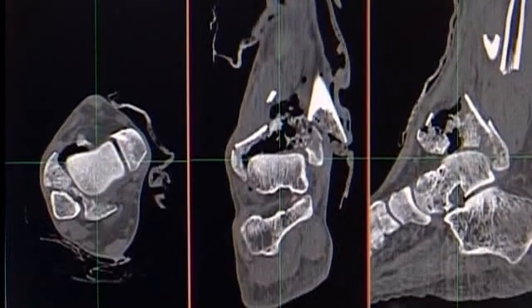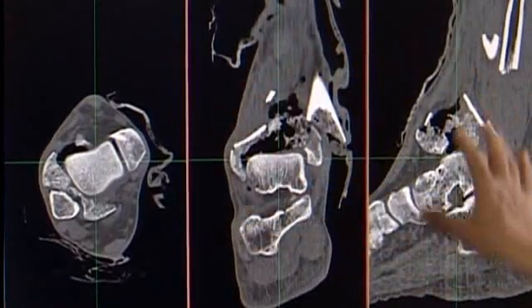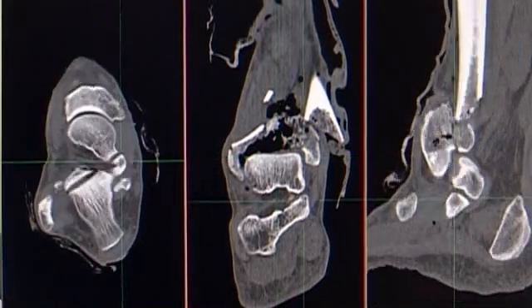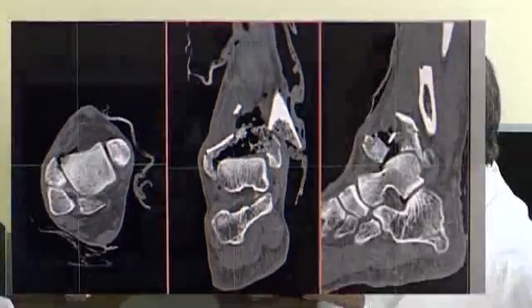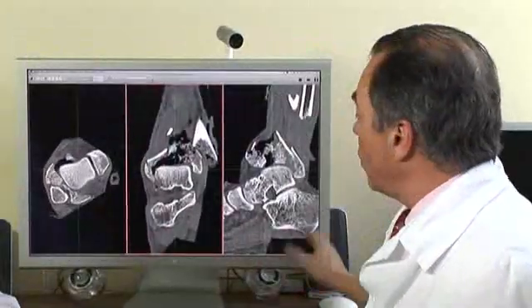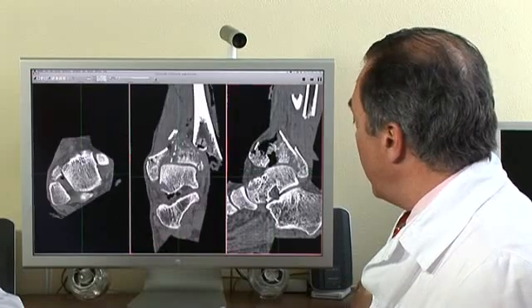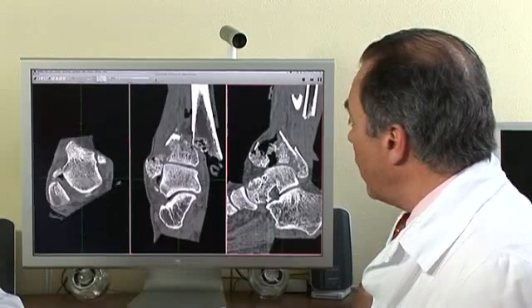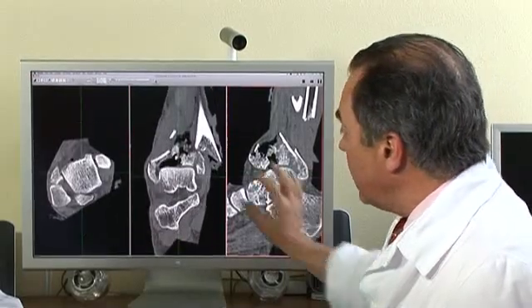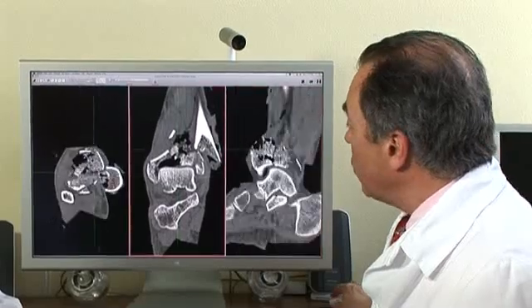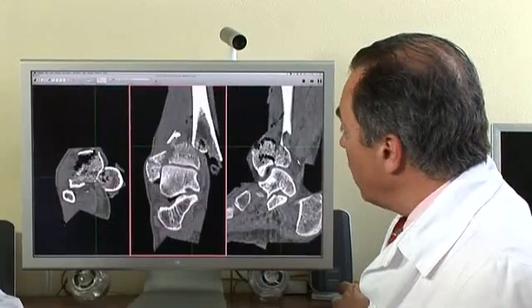We usually use these three views — what we call MPR, multi-planar reformatting — which are axial, coronal, and sagittal. You can browse through any way you want, go and visit any side of the fracture, and do better views of specific areas.